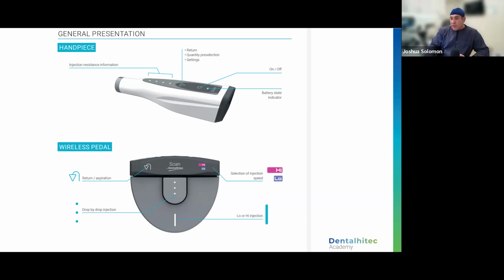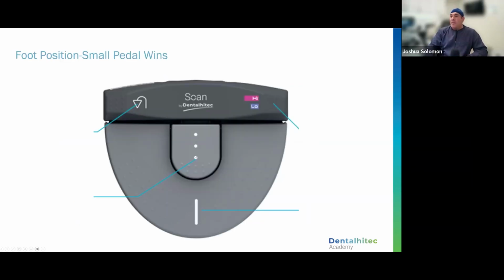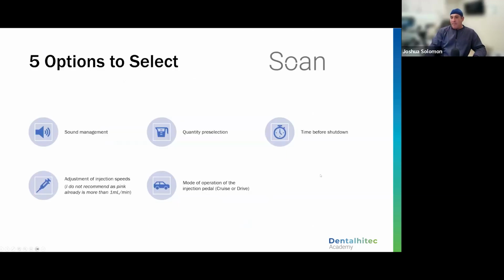So please make sure that before you sit down, and I'll talk about my mantra here in just a minute, you have that pedal in a position where you know exactly where your foot is. And if you wind up stamping on both, the small pedal wins every single time. So if you feel like you're taking a very long time to deliver a quarter carpule of local anesthetic and it's been 2 minutes and it's barely moving, it means you're probably stepping on both pedals or you're still on the small pedal there.